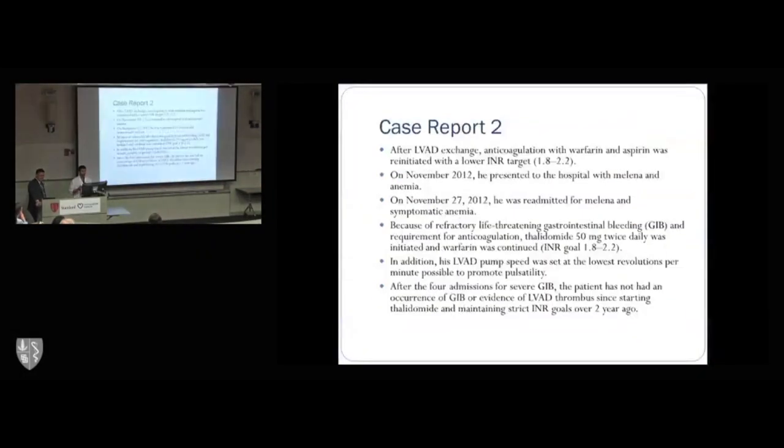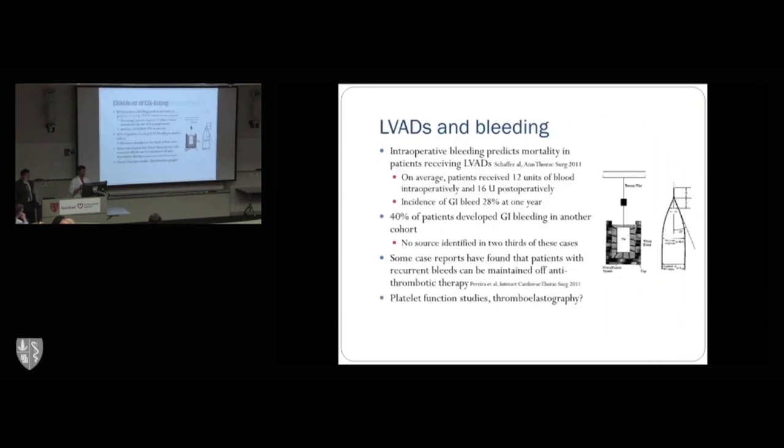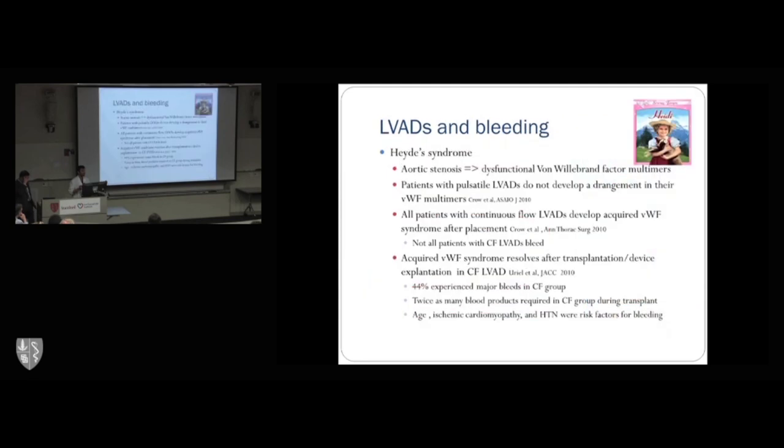So while I'm backpedaling, I think the fundamental answer is that we don't know for sure. But what I suspect is that there are angiogenic factors released when you have an LVAD placed because of the hemolysis and because of the acquired von Willebrand syndrome. Again, we don't really know why patients with Heyde syndrome develop AVMs in their gut either. But they do, and I suspect it's angiogenic. Why do I suspect that?